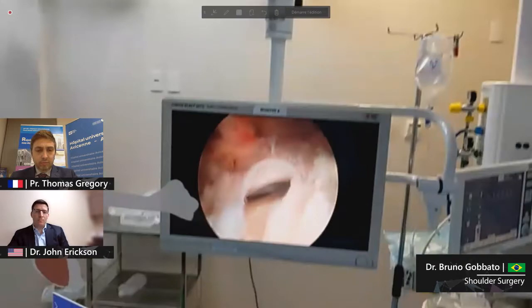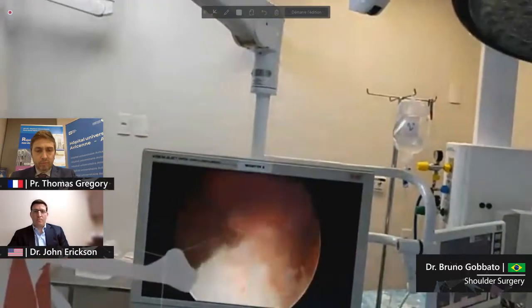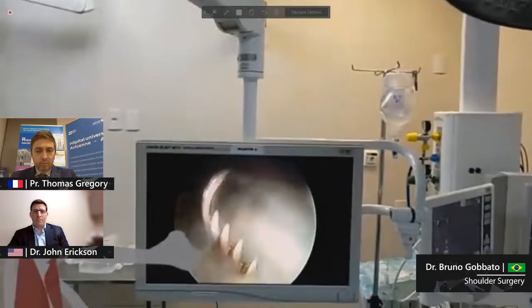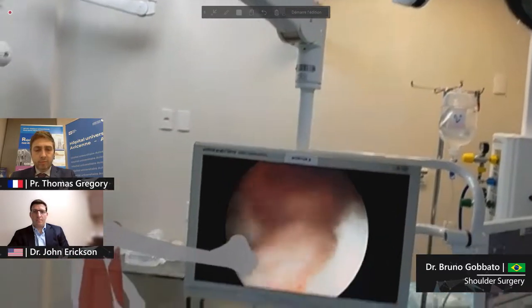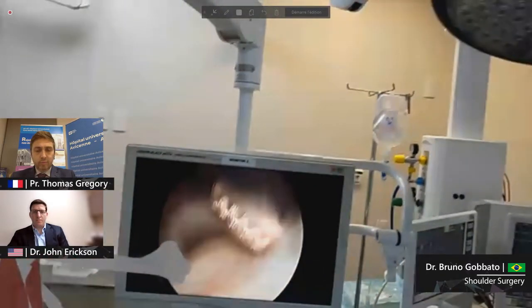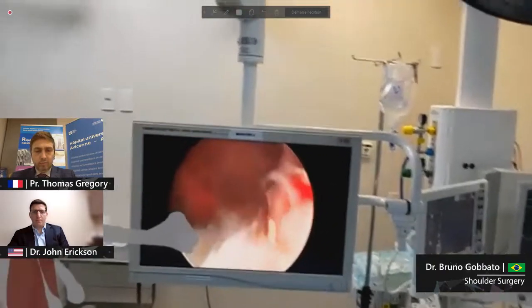As you can see here, we have a very thick bursa, and we are removing it. And if it was a difficult surgery, or if I was a fellow, I could be streaming it for Thomas, I could be streaming it for you, and we could also have an event here, just as we are doing right now, streaming and showing different kinds of surgeries. And I really think we have not yet found how powerful mixed reality actually is.